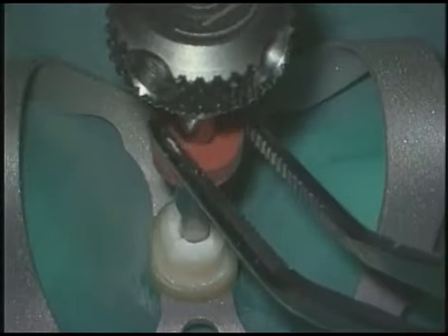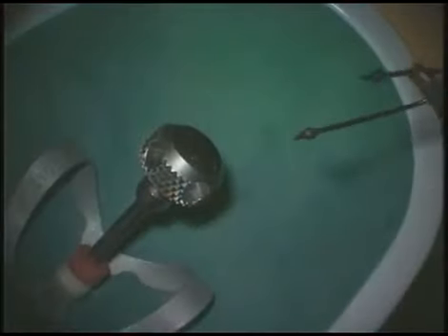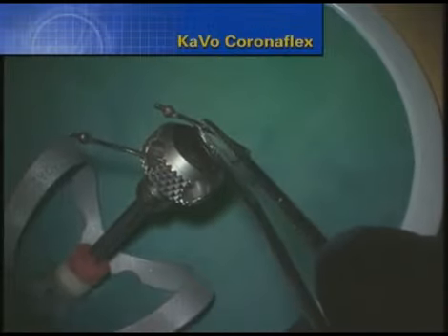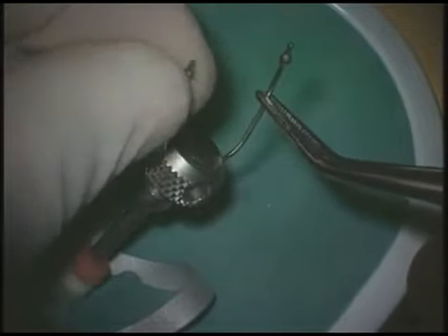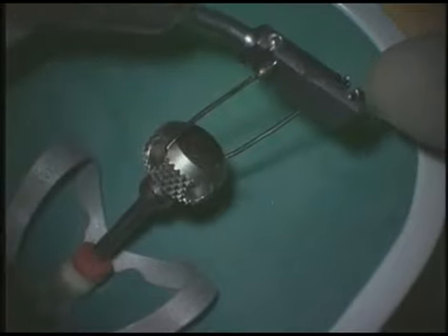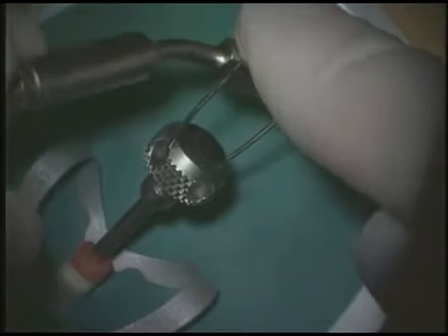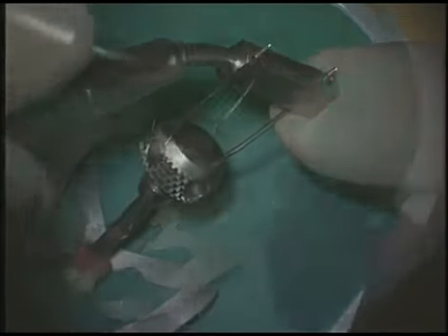Once it's tight, the rubber cushion is placed down over the top of the tooth if we were to use the extracting plier. But in this instance, the Cavo Coronaflex is going to be utilized. The stirrup is slightly modified at its horseshoe end so that it can rotate through the cutouts of the handle. With the stirrup in place, we can now mount the soldered joints into the mounting bar, and once this is mounted securely, then we're going to select the cable Coronaflex.